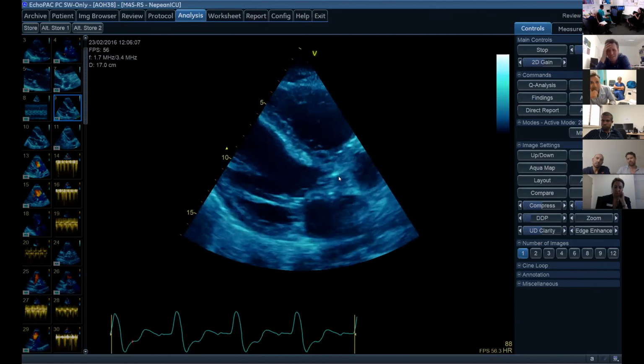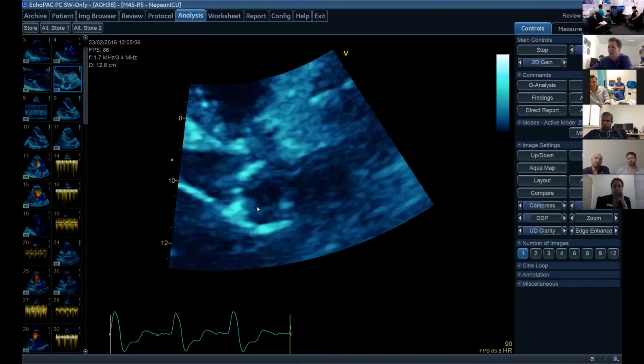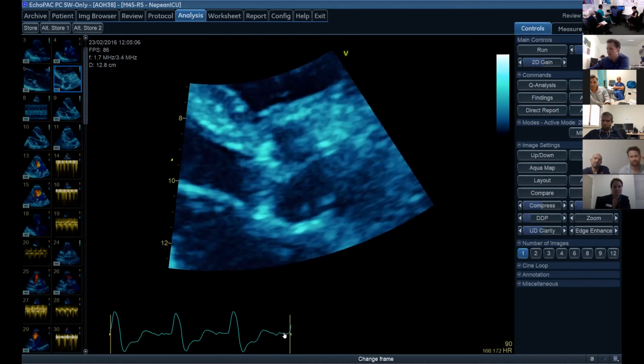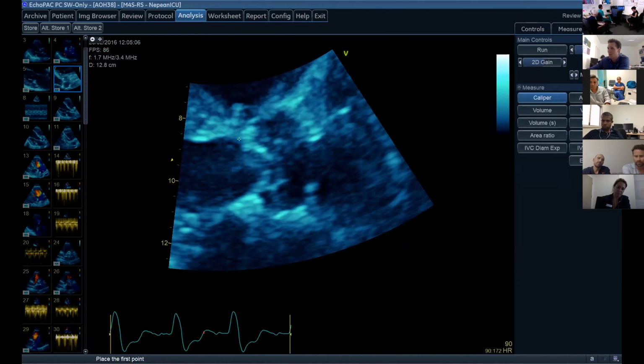Absolutely, and I was going to mention that and didn't. It's in Benita Anderson's book where you read it, and she says in her book you go back 5 millimeters. So instead of measuring at the annulus, on something like this view here, if I paused it, found it at mid-systole, it's probably better on that one there. So at mid-systole, there are two measurements that we could potentially make. One is from where the cusps insert, so it's probably there and maybe there. Yeah, so 2 is about right. Or you could measure it 5 millimeters back in, from there. So these are the two areas.